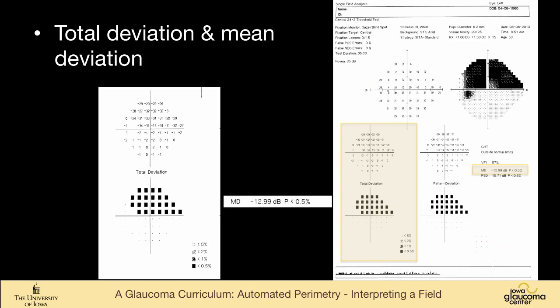Total deviation is a measure of how much this person's sensitivity at each point varies from someone else their age. So this patient is 53 years old, and these points are depressed significantly, as you would expect, looking at the raw data and the grayscale, from somebody else who is 53 years old. It assigns a probability value to the depression of these points, and everything in total deviation is center-weighted, so if you have something that's depressed centrally, it's more important and more reproducible than something in the far periphery.